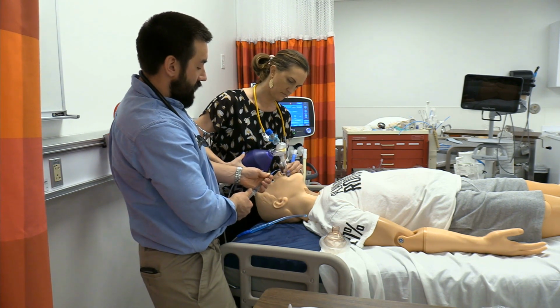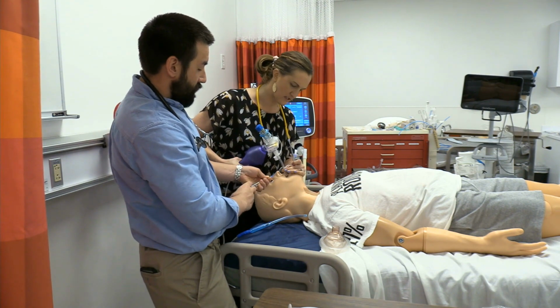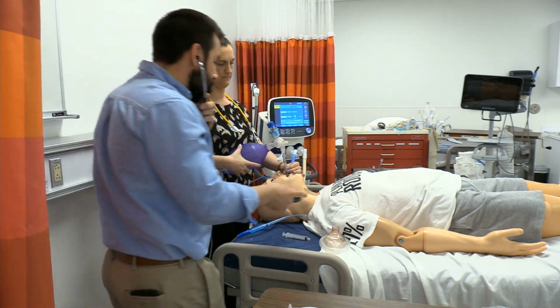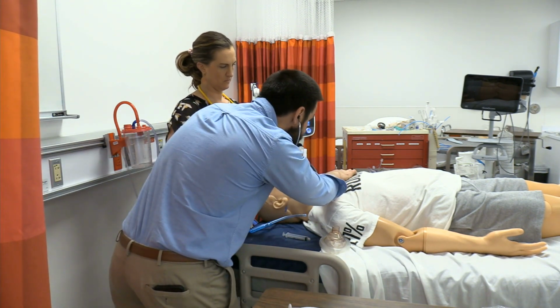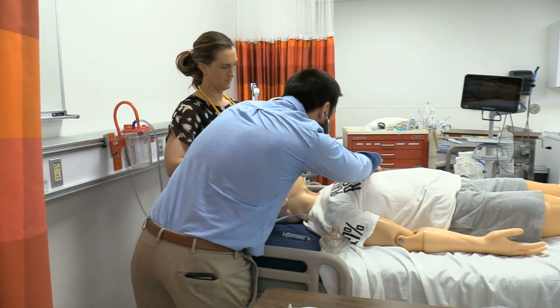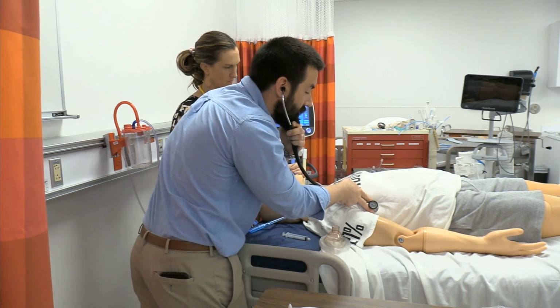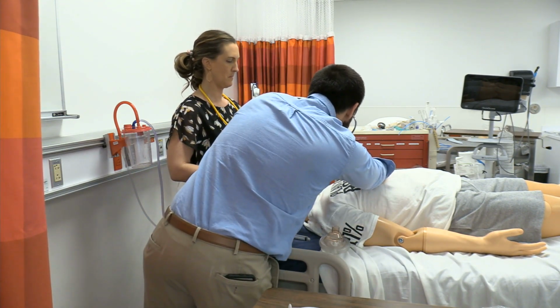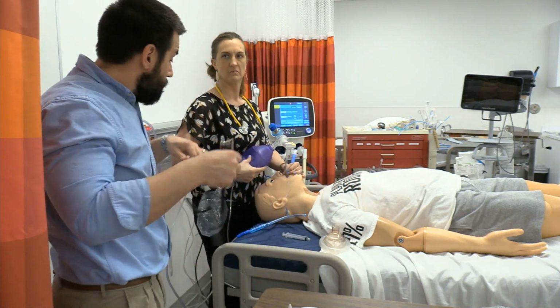So cuffs down. All right. We're out to 23 at the teeth. So 23, cuffs up. Let me take another listen here and reconfirm. Oh, yeah, that's way better. So continue color change, bilateral breath sounds. Yeah, nice work.